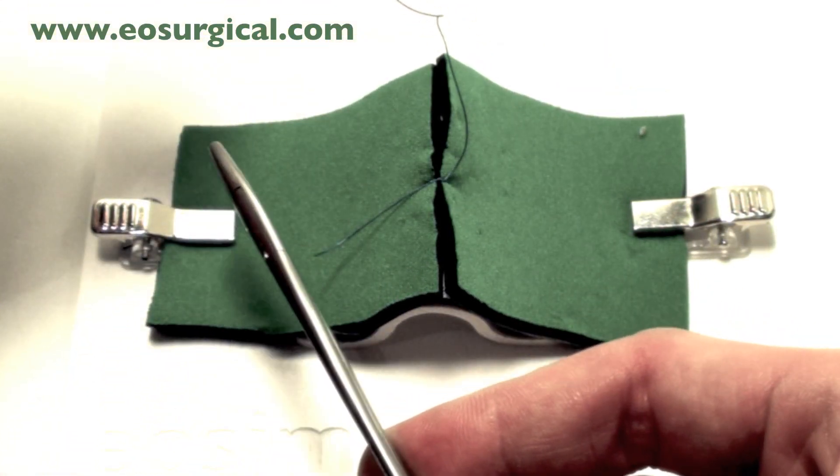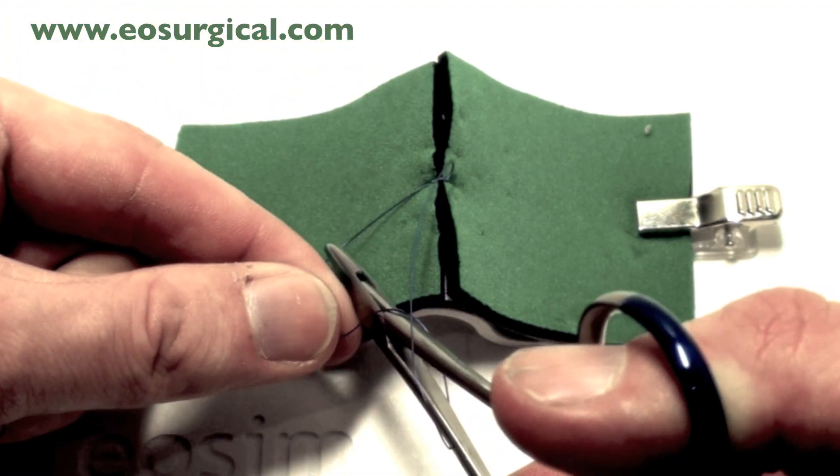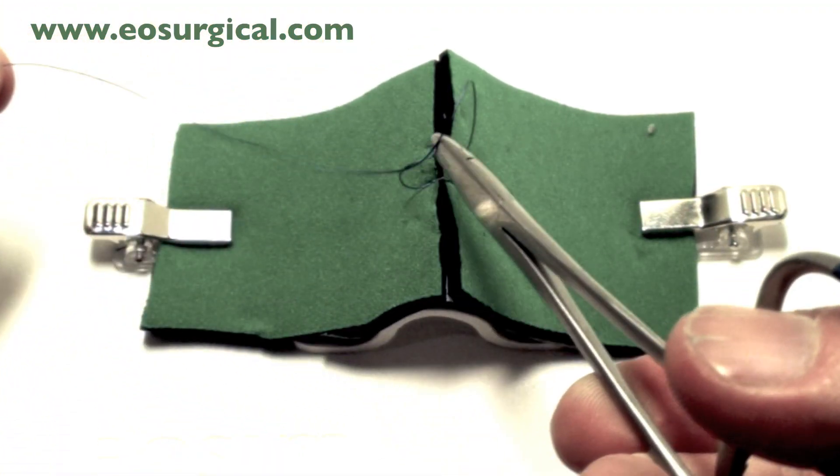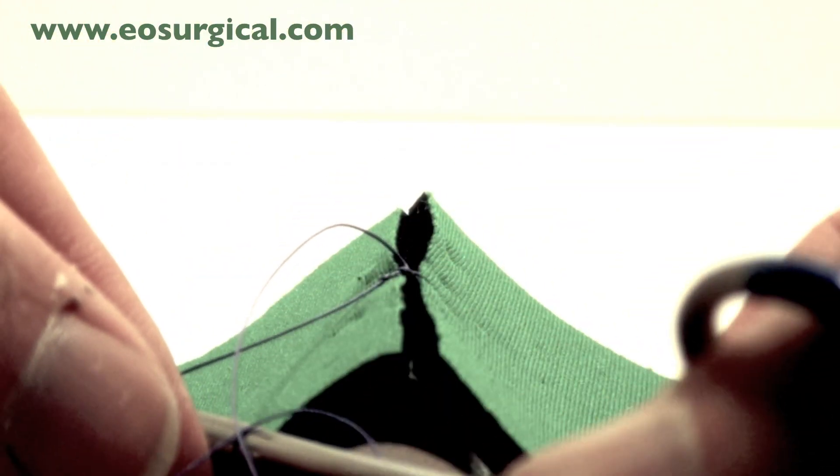Then reverse the process and bring the needle holder from the short end to the long end, and again a flat knot should be thrown as shown here.